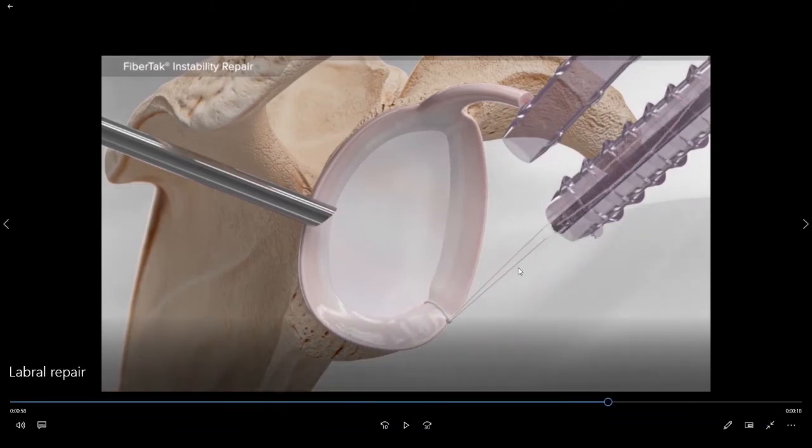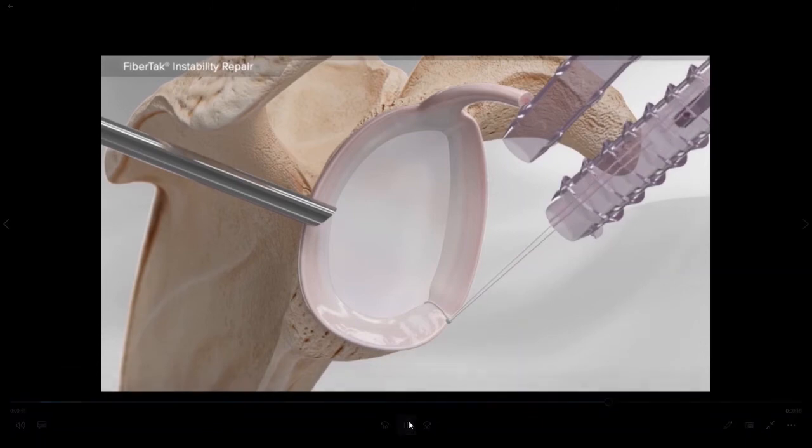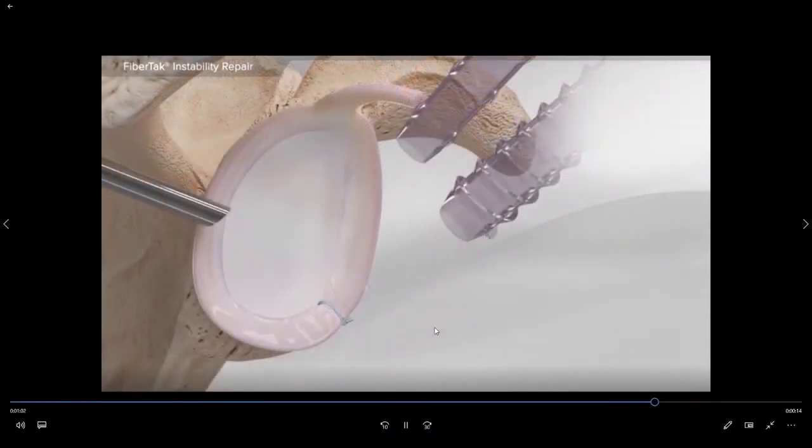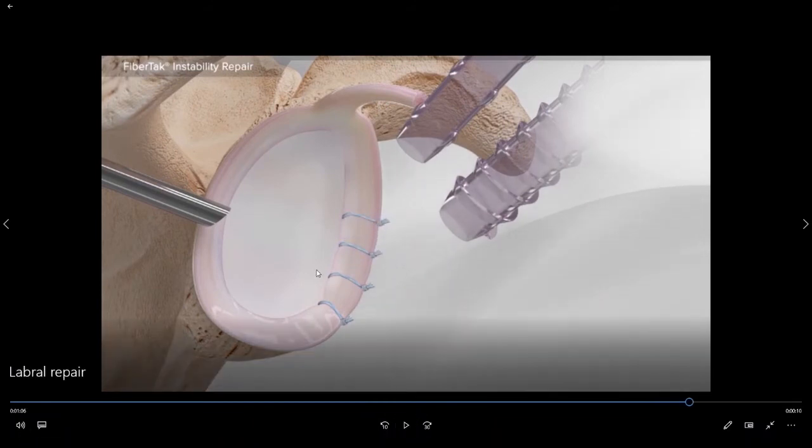As you can see as we tie a knot it compresses the tissue against the bone and it's that compression that we are gaining with the repair that's going to help to stimulate the healing. The excess suture is then cut and removed. We can then move up the front of the labrum if there are additional areas of tearing until all areas of the tear are completely affixed back to the bone.